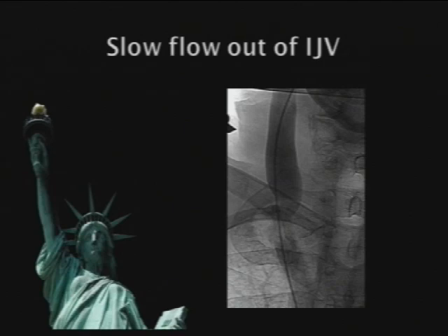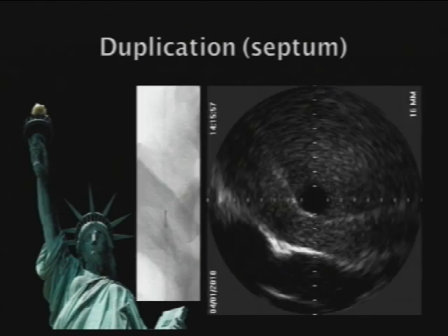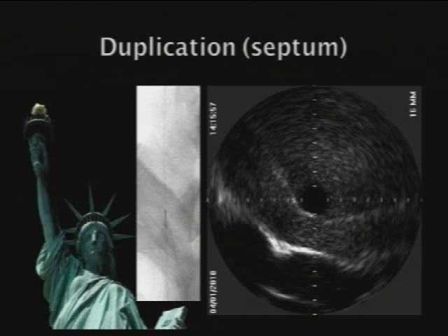Here's an interesting situation where there's slow flow in the vein. The vein looks perhaps a little bit narrow, and you could easily justify doing dilatation of this area. But I did IVUS, and what IVUS showed was this interesting structure adjacent to the vein. It's elongated and certainly a fluid-filled structure. If the patient Valsalvas, this distends. So what could this be? Having done it a few times now, I know what it is — I would call it a duplication, an incomplete duplication of the vein.